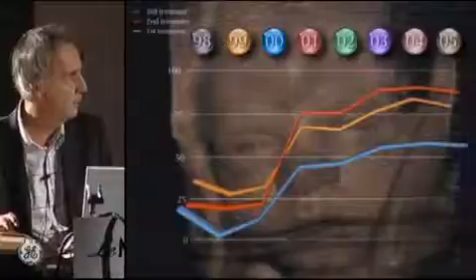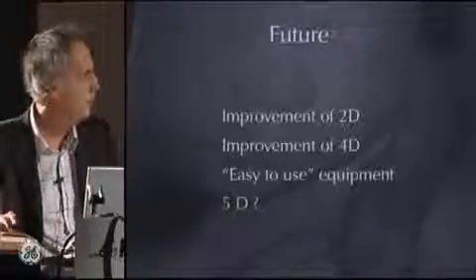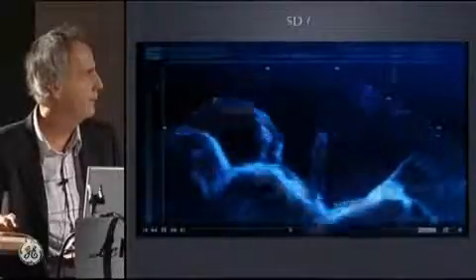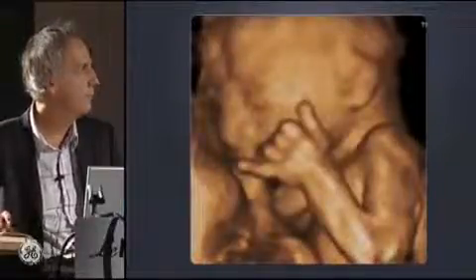And what could be the 5D? Maybe this. You can see twins. And this one doing a gas pass. And the other don't like the odor of this. Now I will show you some nice picture of fetus during the pregnancy.